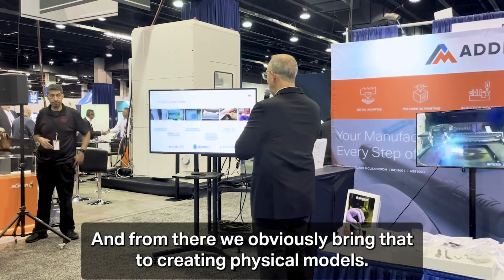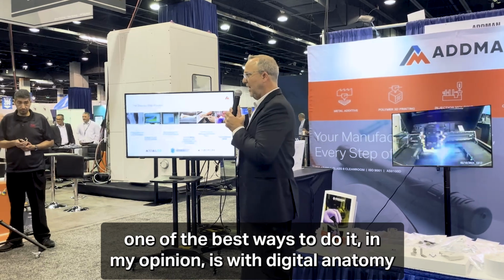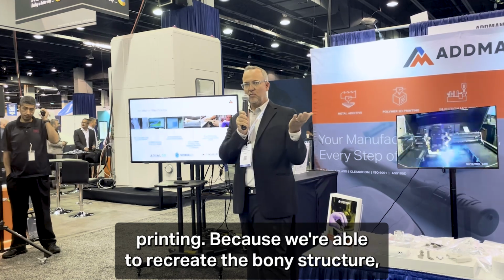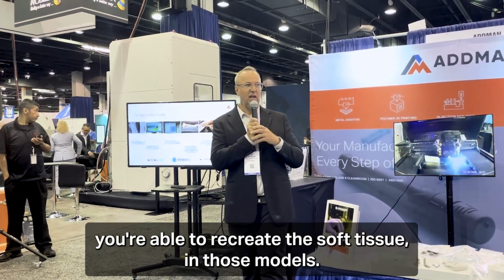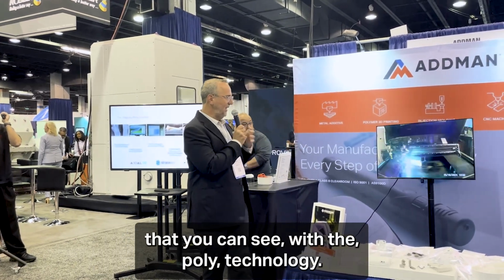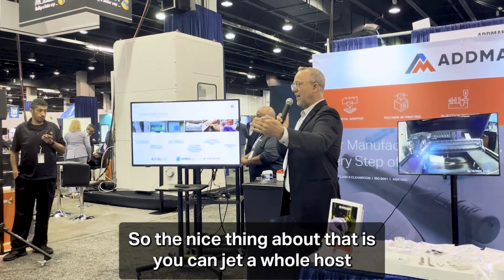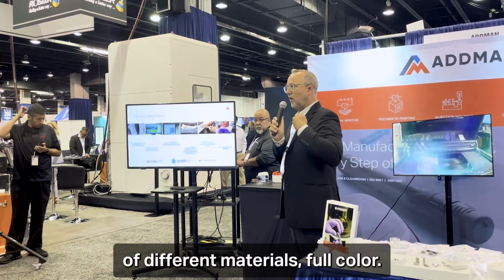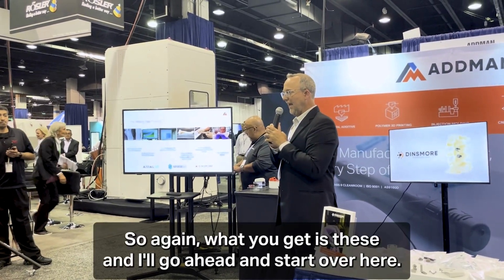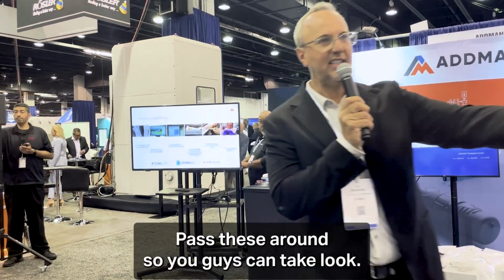From there, we obviously move into creating physical models. There's a whole different host of ways that we do that, but one of the best ways to do it, in my opinion, is with digital anatomy printing, because you're able to recreate the bony structure and the soft tissue in those models. The way that's done, I have a video playing behind me that you can see, with the PolyJet technology. The nice thing about that is you can jet a whole host of different materials, full color, flexible, rigids, all in one shot. So at the end, what you get is these. I'll go ahead and start over here and pass these around so you guys can take a look.